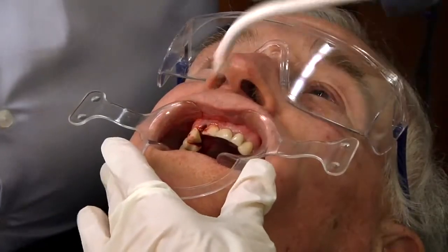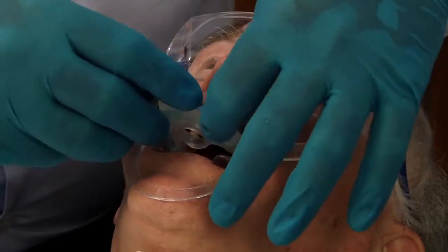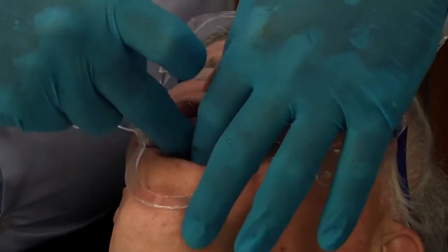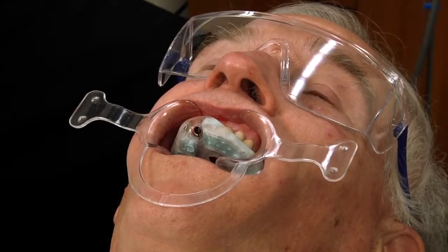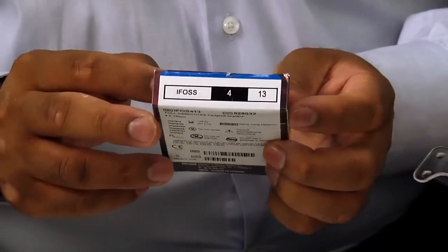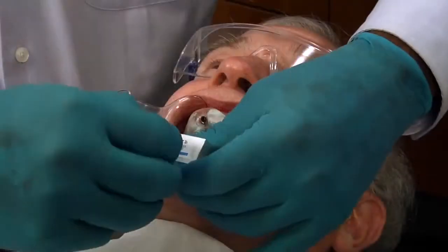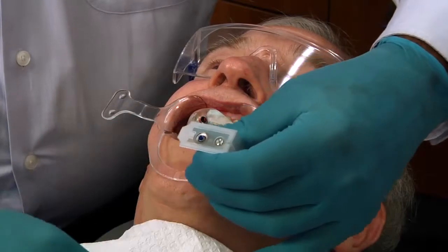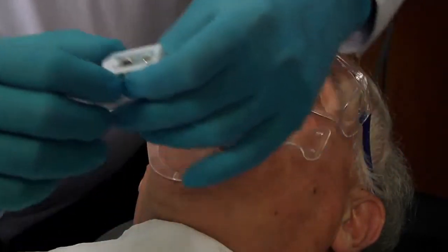As I mentioned earlier, true guided surgery involves placing the implant directly through the guide. So we're going to place our guide back in. In this particular case, we're going to use a Biomet 3i 4x13 implant. We just gently open this, and there you can see the implant and the cover screw.